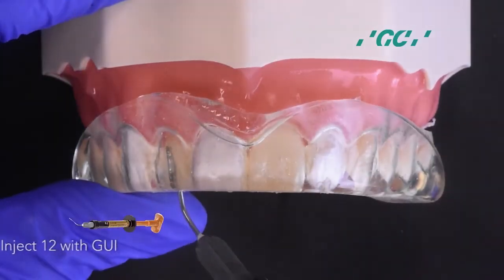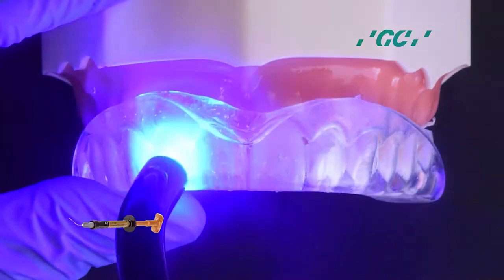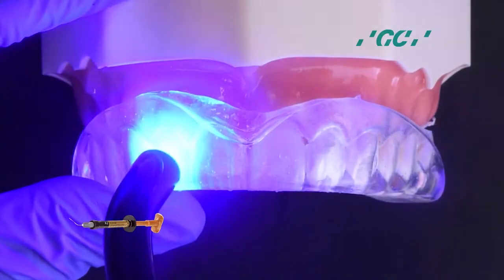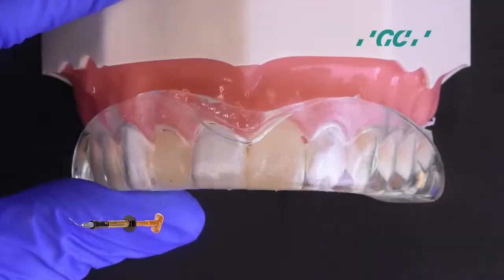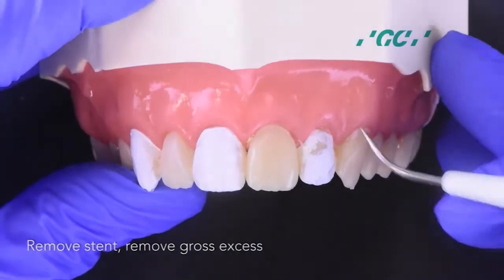Inject 1-2 with Genial injectable, then light cure. Take out the stent and remove the gross excess.